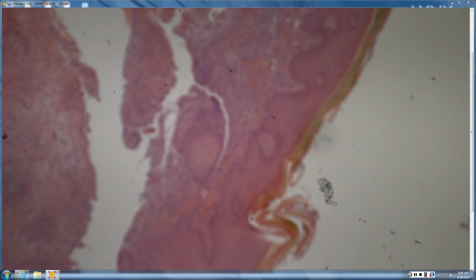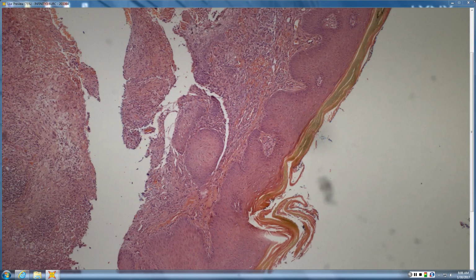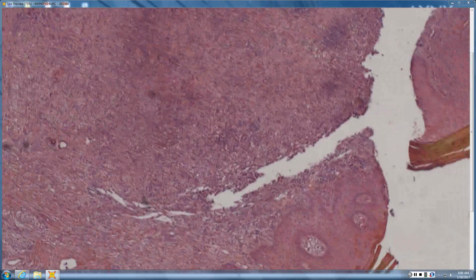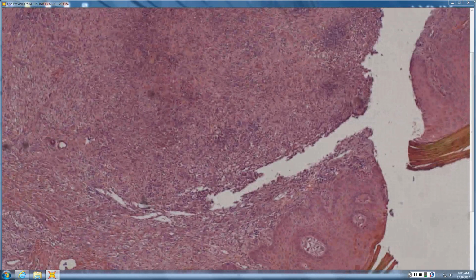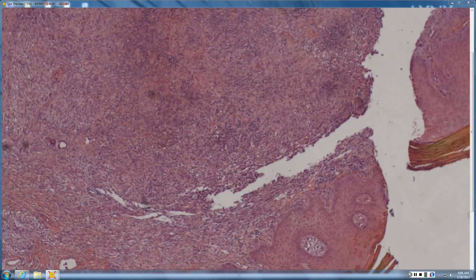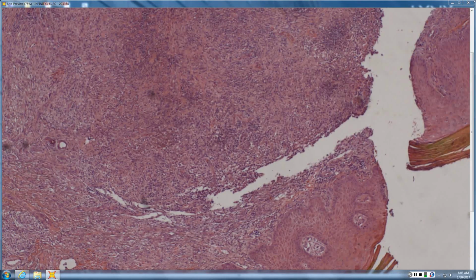They are intracellular, but not so much in a vacuole, and they're usually harder to find. You can do plastic embedded sections, cut 1 micron thick, which helps to see the organisms in granuloma inguinale. And then the clinical helps a lot, that it looks like a chronic beefy red granulation tissue venereal disease.